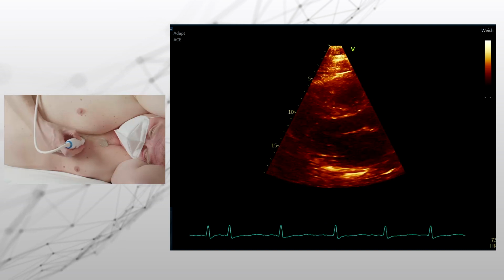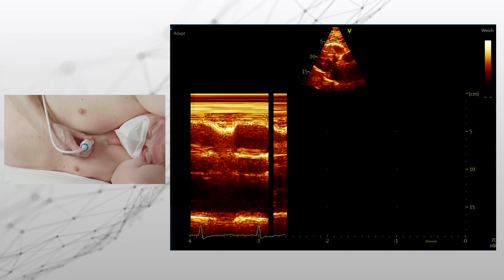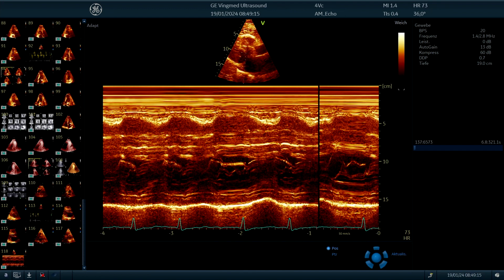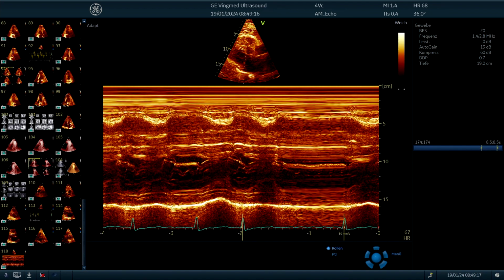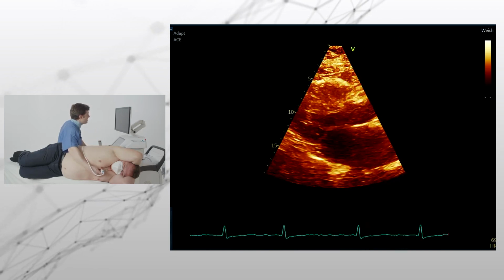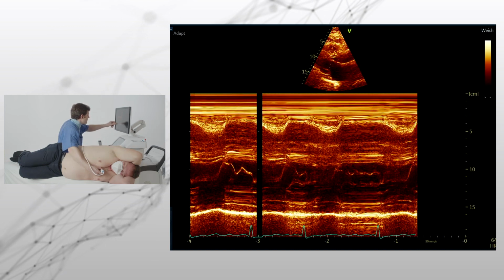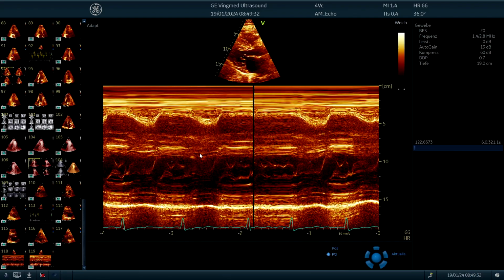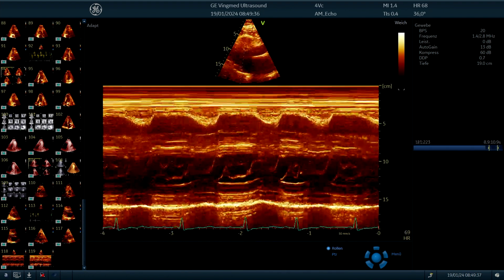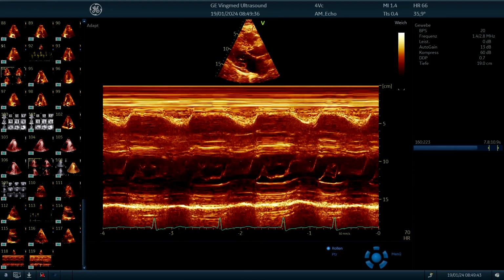We can also try, just for demonstration purposes, to go back and use the M-mode in this area, because the M-mode simply shows the structures over time, and here this SAM phenomenon is present. But be aware that whether it is a chordal SAM or really LVOT obstruction, it doesn't really matter for the M-mode. The M-mode just depicts the structures you see. So that's the mitral valve opening, and then you have this pulled motion of the chordae tendineae towards the LVOT, here probably the best signals.